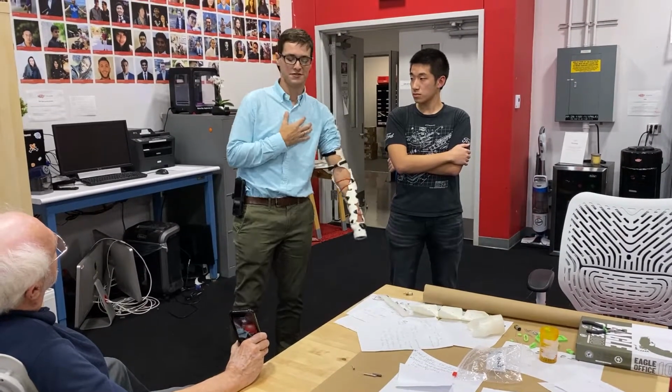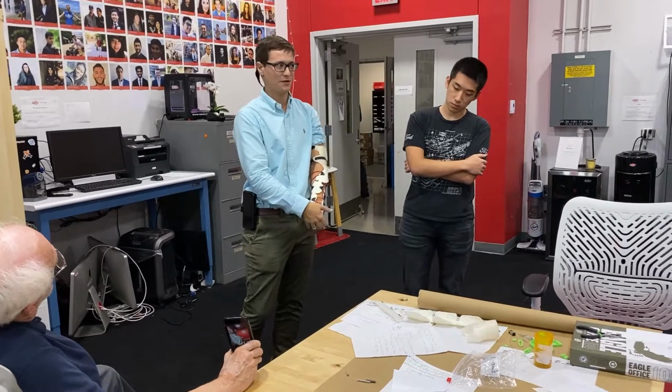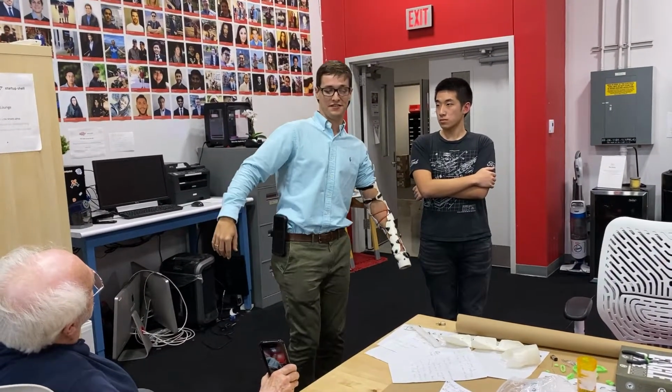As far as weight and center of gravity, those issues, I'll tell you, when I put on the bionic hand, I recommended that we get a shoulder harness too, just because I know I will fatigue after a while. It's heavy. I've got a bad back, and if you're pulling me to one side, it can cause issues.